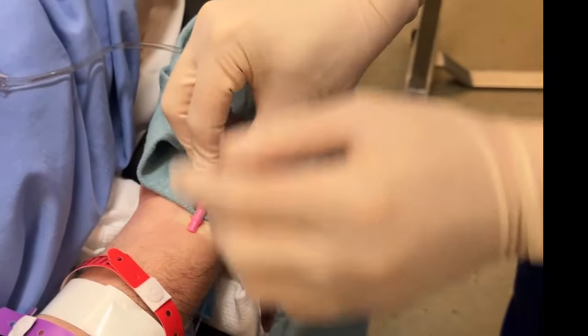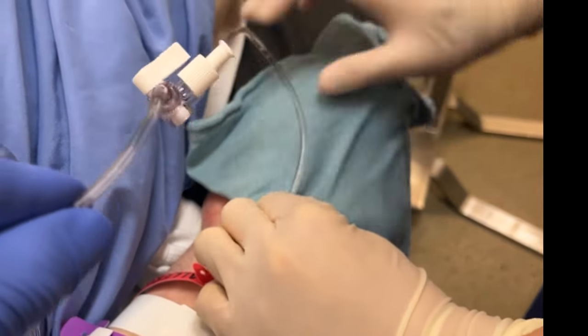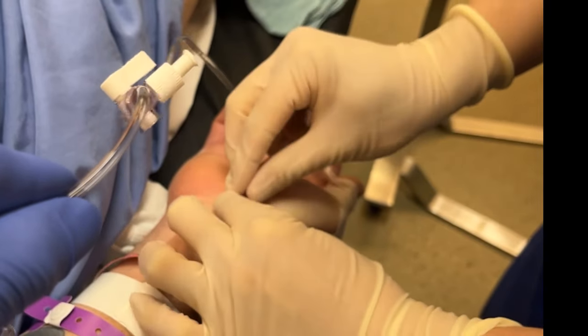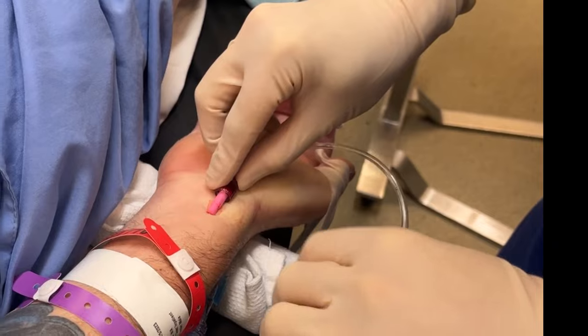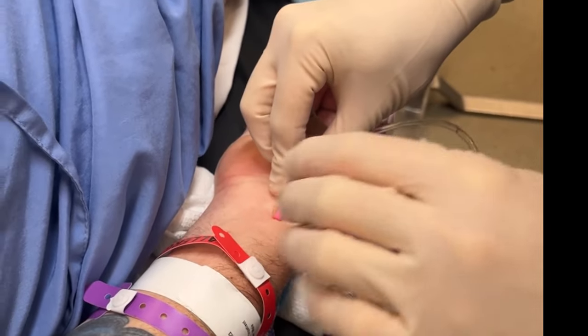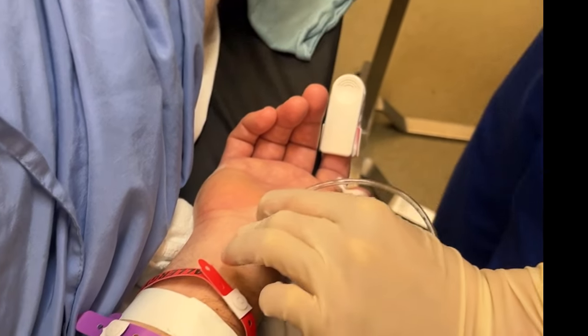Before taping the cannula in place, rotate the cannula and tubing so that the fixed loop of tubing is facing out lateral towards the thumb, rather than trying to rotate it only after you've taped everything down. The key with taping the catheter is to avoid putting mechanical stress forces on the cannula that might kink it and dampen the arterial waveform.